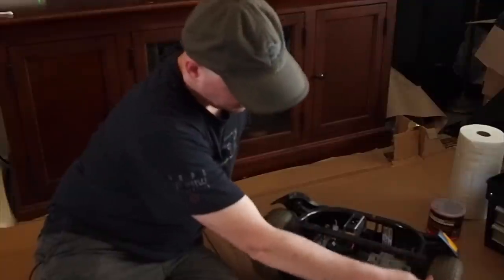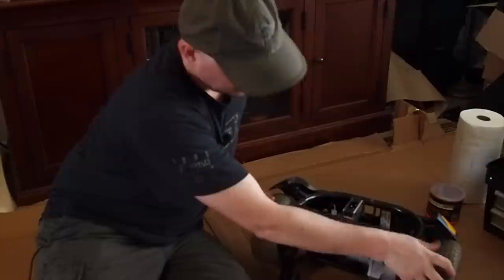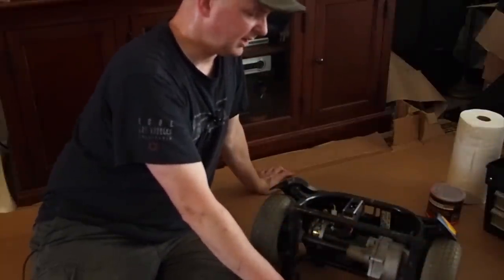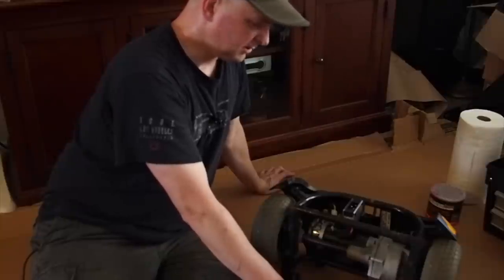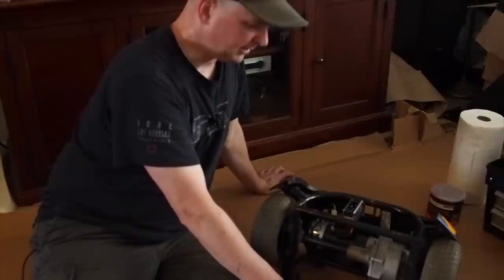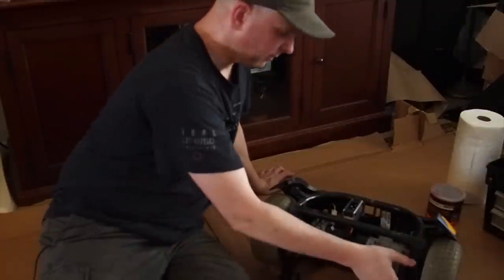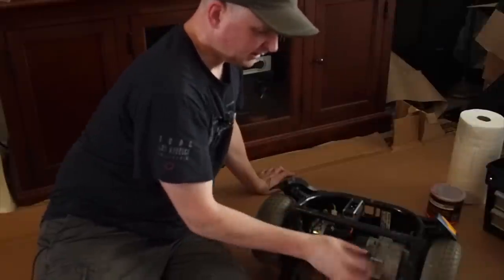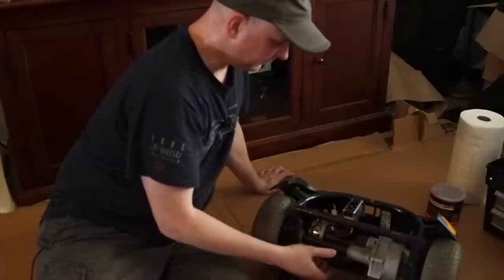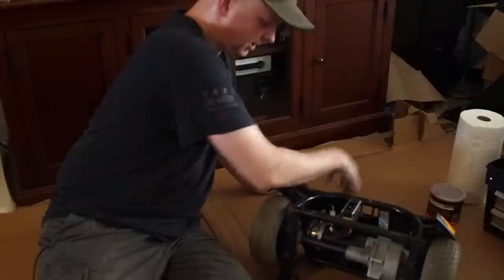I don't think that should be there. If they go the other direction, it's fine. But this direction, you can hear the noise, and that back pressure is what I'm trying to get rid of. So I should be able to know whether or not I fix this thing pretty quickly here. So essentially, I'm going to take apart these four bolts, all the bolts that are holding this piece to this piece of the transaxle. I'm going to take apart the arm, this clutch arm.